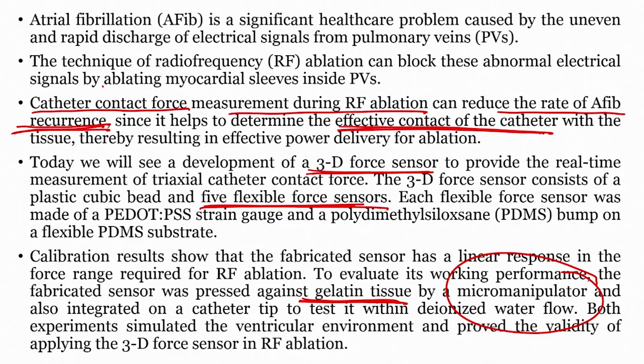So, when you perform this kind of experiment, we have measured the catheter contact force in water to understand the effect. Both experiments simulated the ventricular environment and provided validation for applying the 3D contact force sensor in ablation, which is your RF ablation.